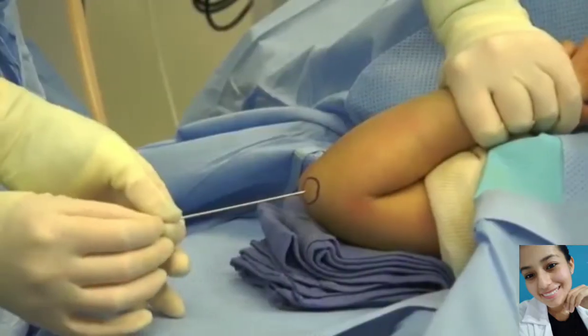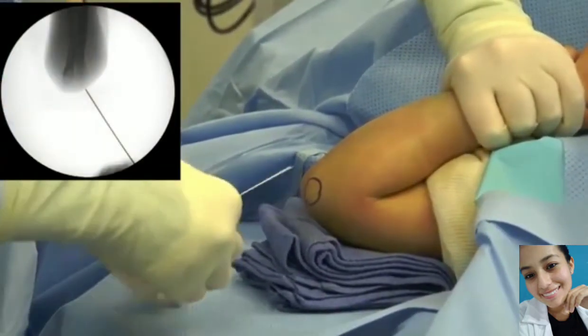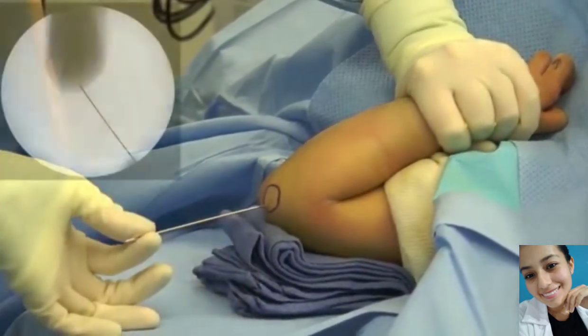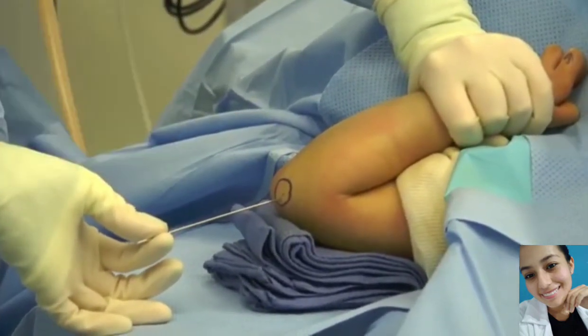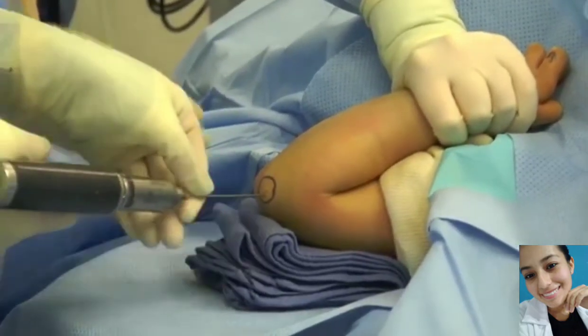The arm is placed up on towels and a target is drawn out over the capitellum. Once fluoroscopy has been used to mark out the trajectory of the pins, they are placed through the skin, aiming to get maximum divergence at the fracture site. The assistant will hold the K-wire and then the surgeon will bring in the wire driver.